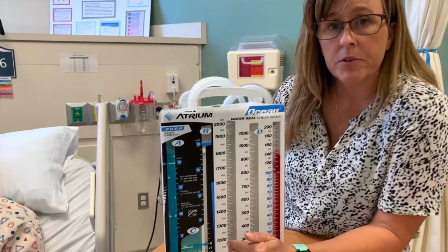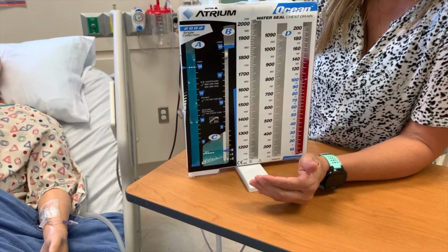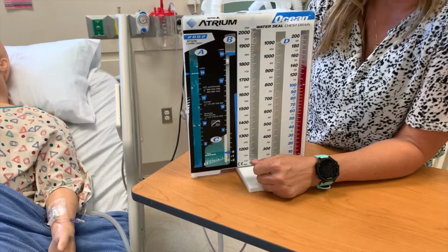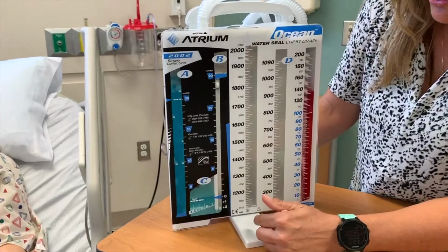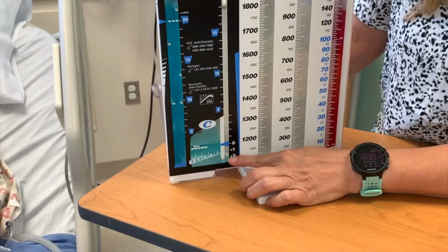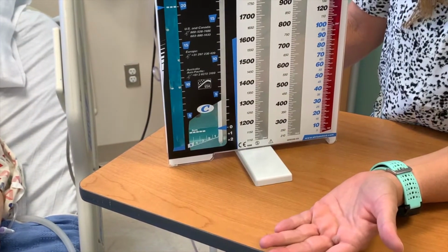Now we got our water seal chamber, guys. Our water seal chamber is gonna tell us about a complication that can occur, and that's that air leak complication. So when we're looking at our water seal chamber and we come in to take care of our patient to look at it, we're looking at this little ball here. This little ball is that tidaling ball that I told you about.